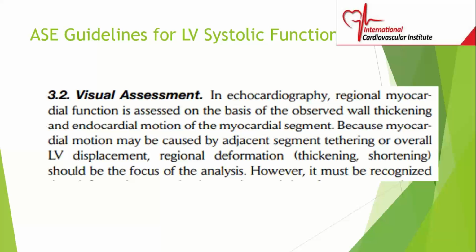What about visual assessment of the heart motion? In echocardiography, regional myocardial function is assessed on the basis of the observed wall thickening and endocardial motion. So when we look at the heart muscle, we look at thickening of the muscle and motion as well.